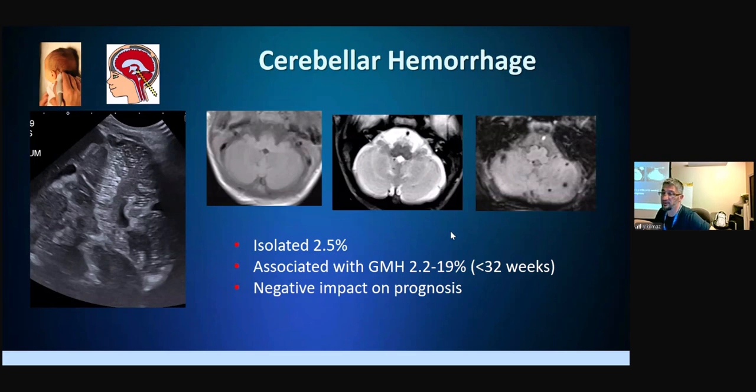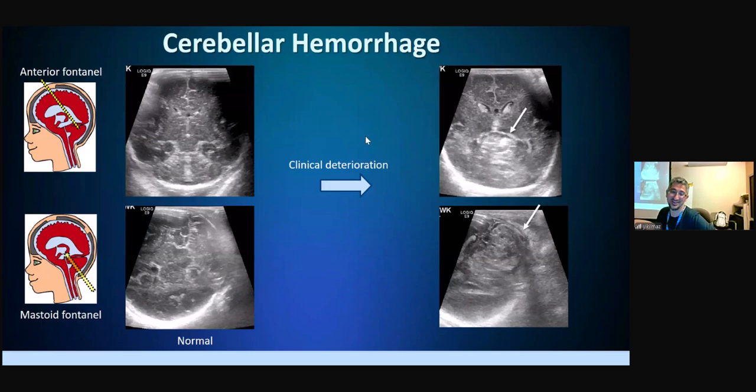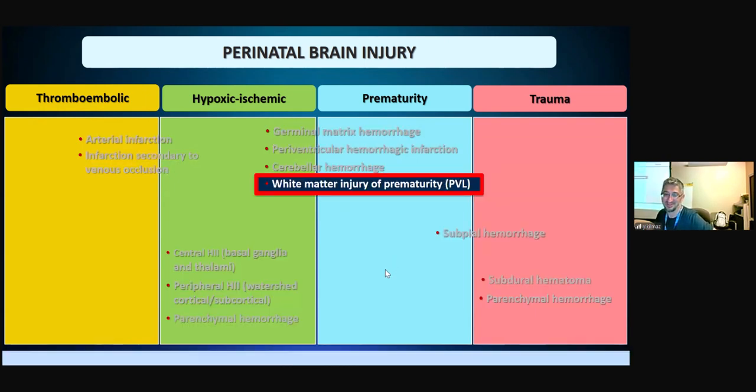If you tell a general radiologist, subpial hemorrhage, they would say, "Oh no, there is no such thing." No, for sure. I'm pretty sure. This is very new. Yeah. I remember 2 years ago I reported as such, and they called me, and said, what do you mean subpial hemorrhage? And I tried to explain.